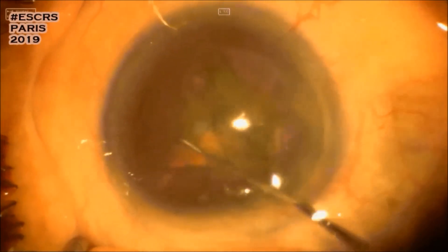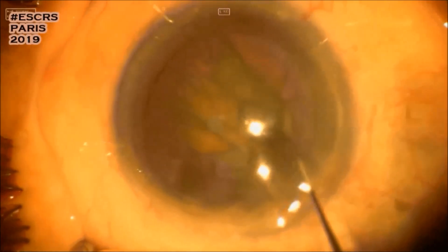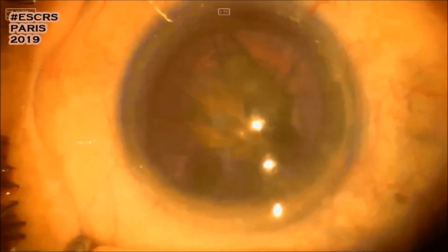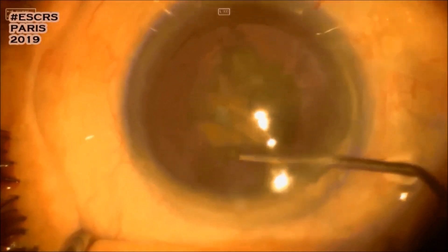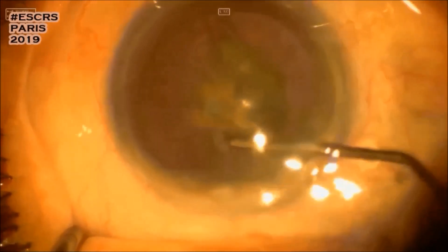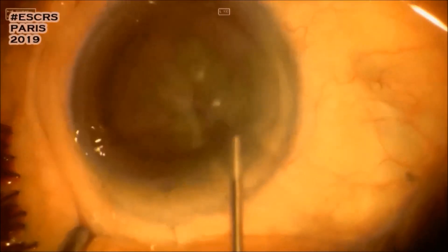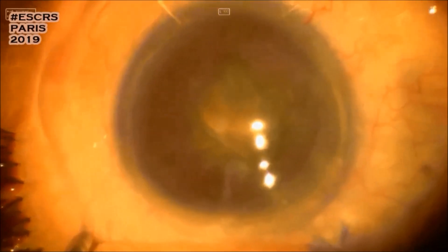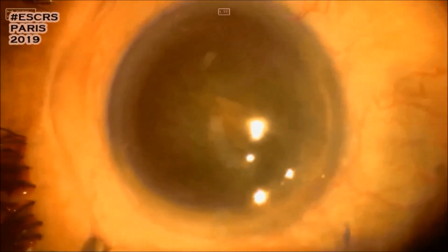Uh-oh, the nucleus is not rotating. My coach told me not to insist and to try the hydrodissection again. Okay, now it's quite better.